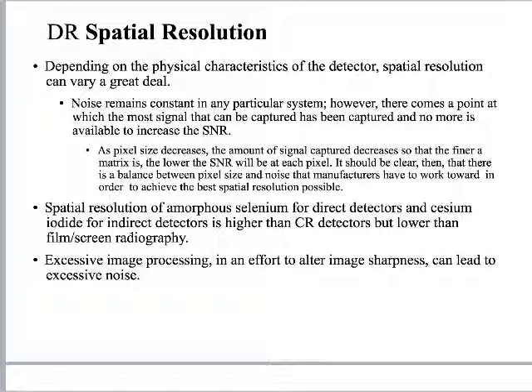But what we're saying is, at the same time, as we shrink the pixel size down, the potential for noise actually increases. So there's a tension there, right? So just going with the system with the best spatial resolution is not always the answer, right? The best spatial resolution can increase image noise. So we just have to kind of work that out, right? And think about these things.